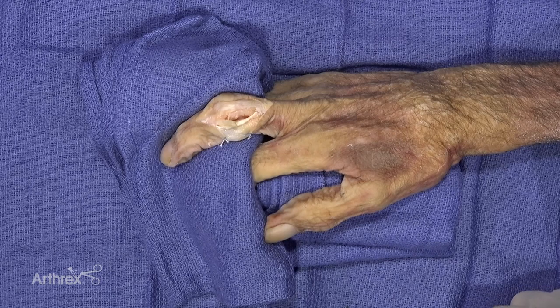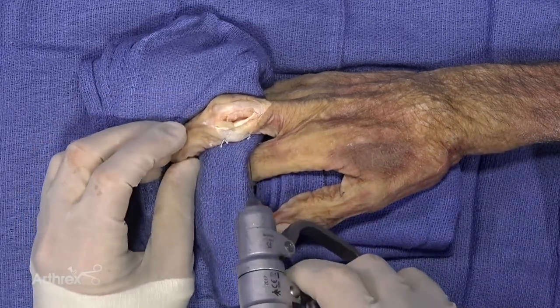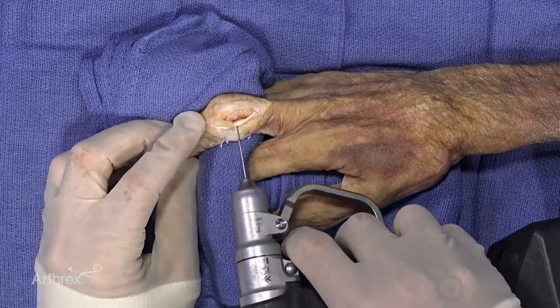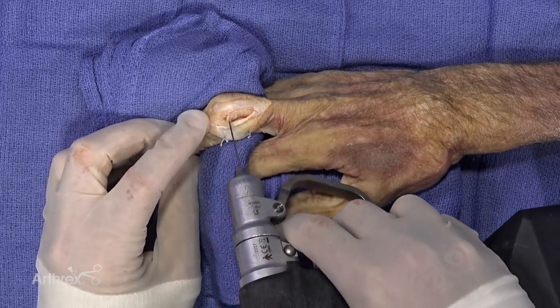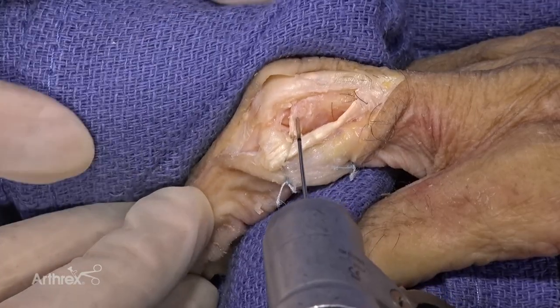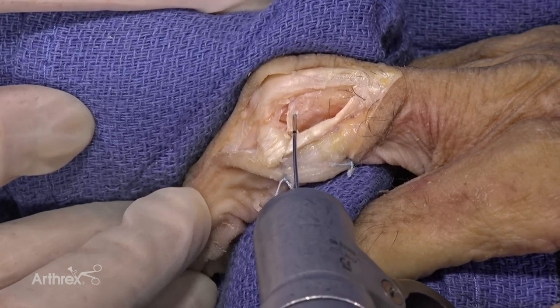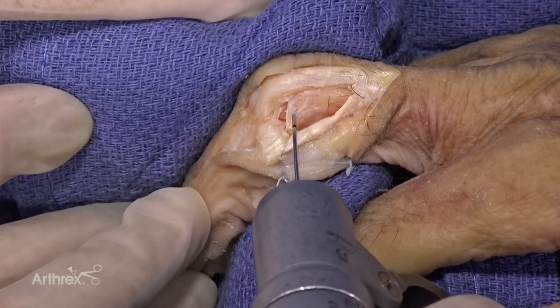So we're going to go ahead and put the 0.86 millimeter K wire in here. This will be in the footprint of where the collateral ligament had pulled off. You'll notice I keep the finger slightly flexed so as to not over tighten the repair. So we'll drill this pin in, and you can see that there is a depth stop on it. We'll go all the way down to that stop.